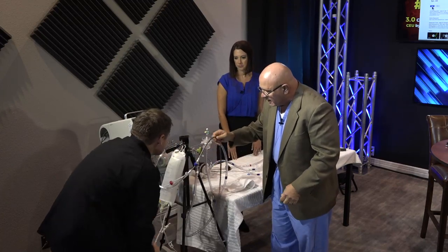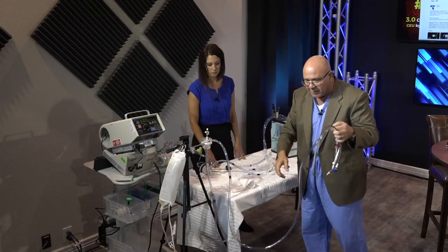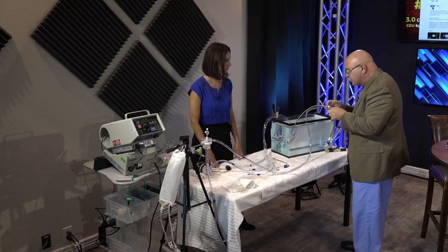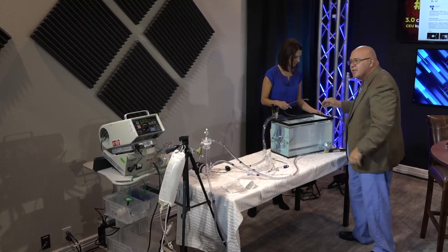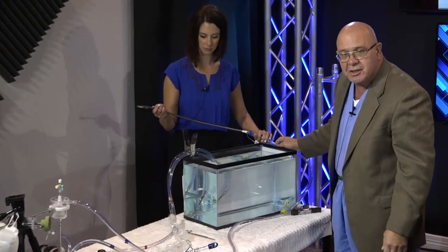Okay, so I've already attached everything to it, and it's not necessarily how it would actually look, but just for time, this is going to be our AngioVac, and I'll hand this to Professor Stephanie. All right. And that's what's going to go into the right IJ. So we're fem-fem here. The approach we're going to use is right IJ.